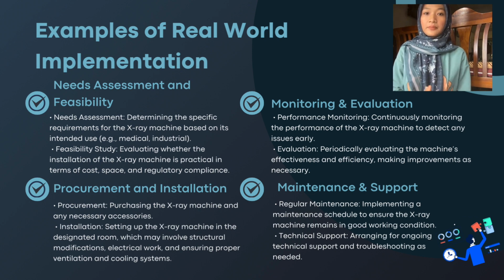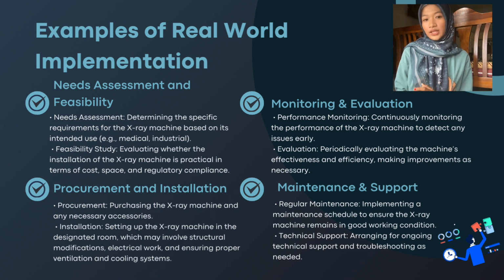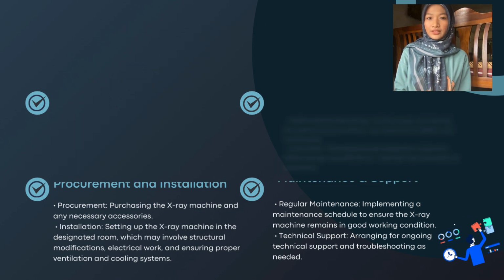Last but not least, maintenance and support. Alright, we've got our X-ray machine up and running, but the job's not over yet. Just like how we take care of our gadgets and toys, we've got to make sure our X-ray machine stays in tip-top shape. So we'll set up a schedule to check on it regularly, kind of like a doctor's checkup, but for machines. We clean it, fix any parts that need fixing, and make sure it's running smoothly. And if anything goes wrong, don't worry, we've got a team ready to swoop in and fix it up quick.